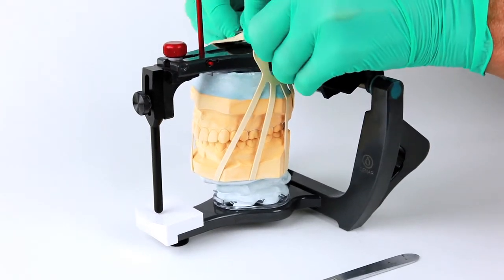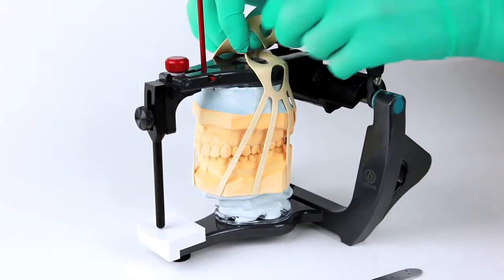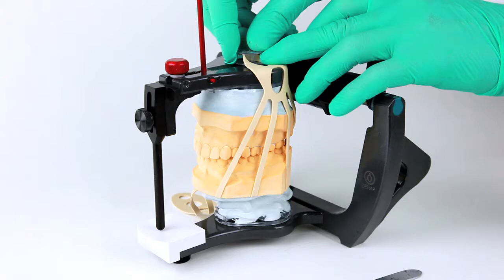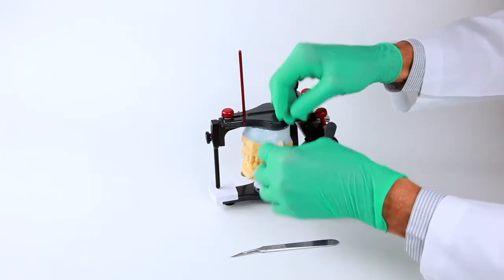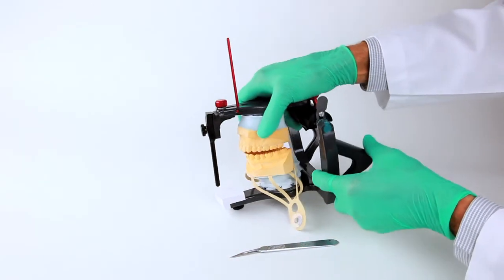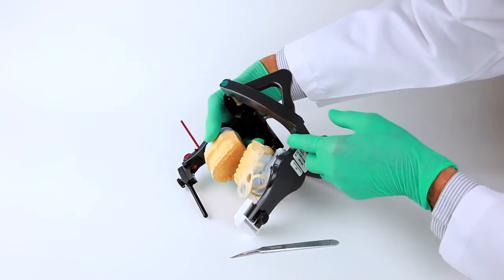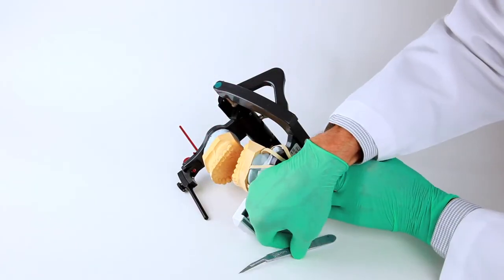After the stone has adequately set, the flexi-mount can be removed from the mounting button on the articulator arm. Caution should be used not to put excessive force on the cast at this point. A second layer of stone should be added to give adequate strength to the cast mounting.